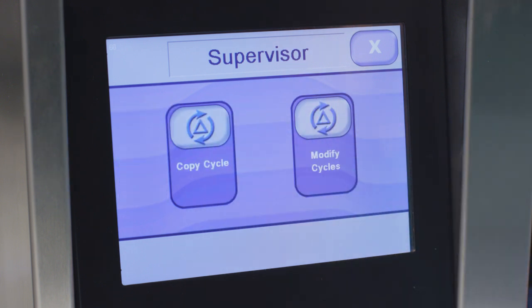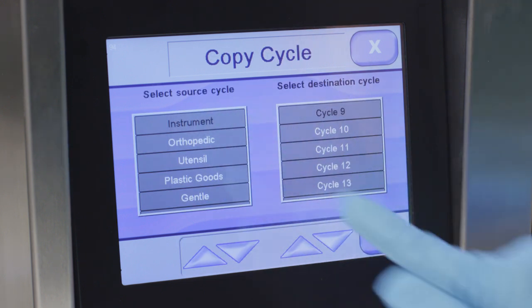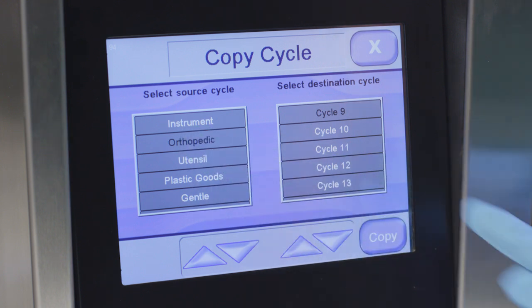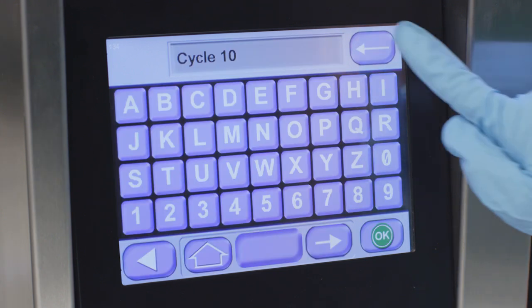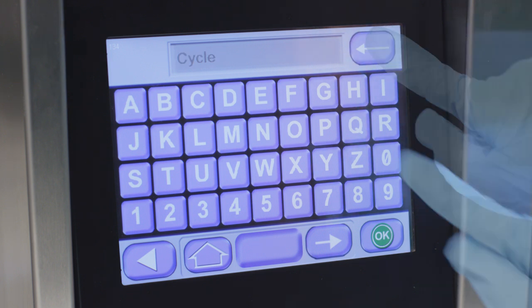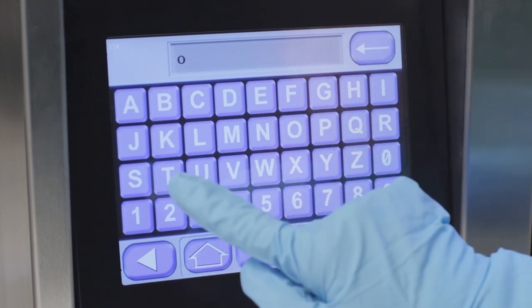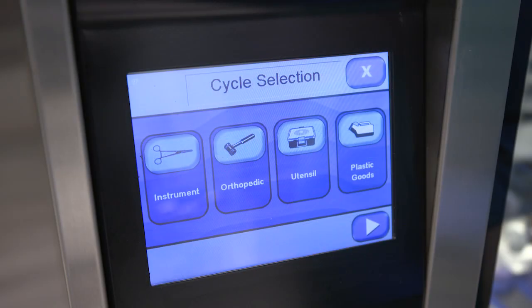You can also create a custom cycle by copying a cycle, changing its parameters, then naming your new cycle. From the main cycle screen, choose copy cycle, then select the cycle to copy. Press the backspace button until the cycle name has been erased, then type in the name of the new cycle in the modify cycle screen. The control stores all of your preferences and customized cycles. If you experience a power failure or need to unplug the washer, you won't have to reprogram cycles.